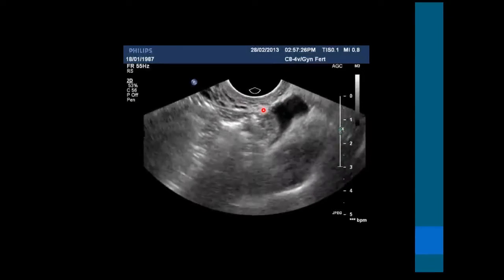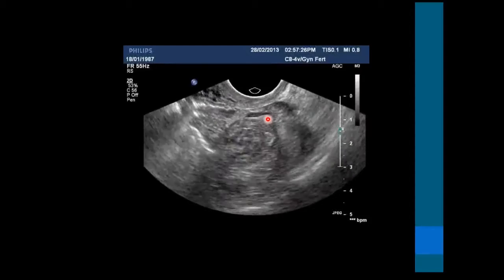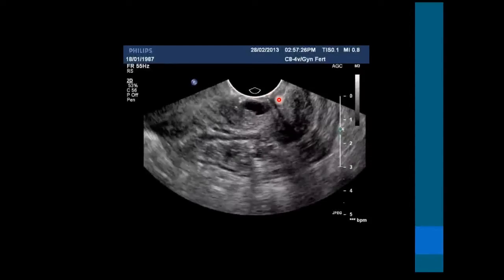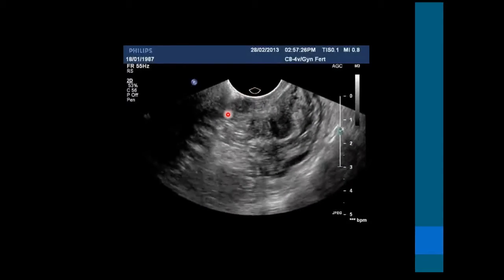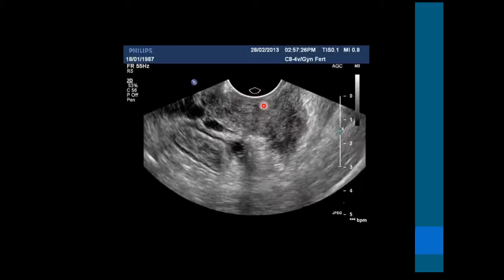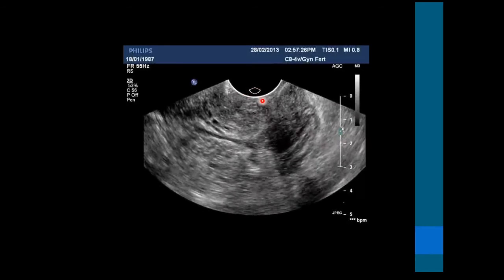This normal vagina here, this is sliding nicely, but if you then go to the sides, this is still all normal vagina, you suddenly see this big nodule coming into view here with a bowel nodule stuck to it. So this is a very large nodule in the vagina with a bowel nodule stuck to it.